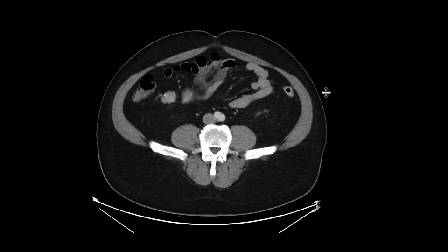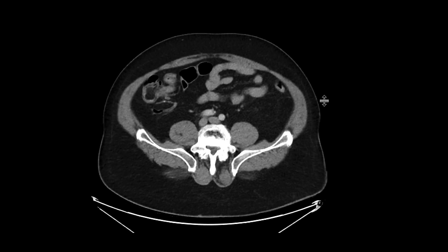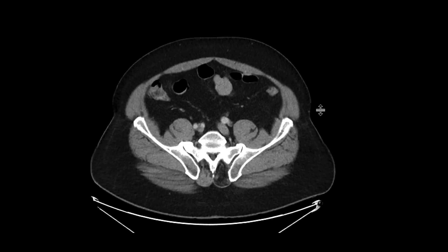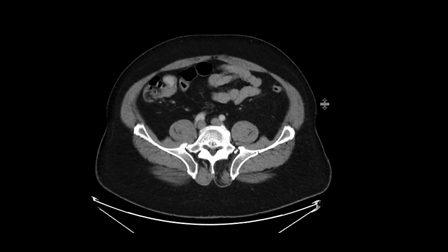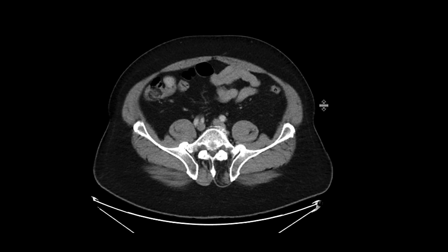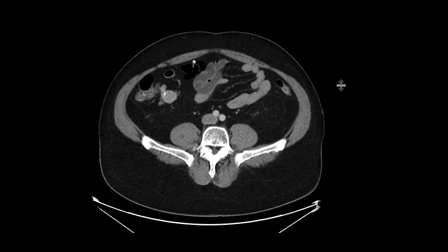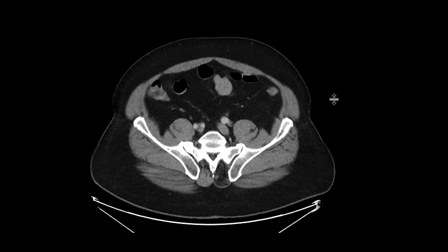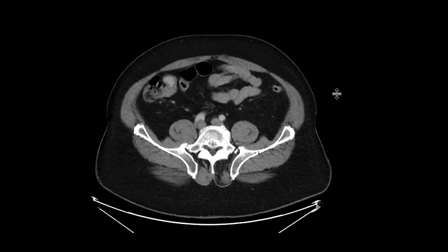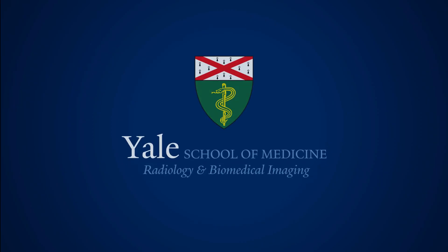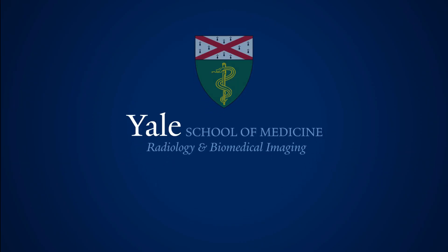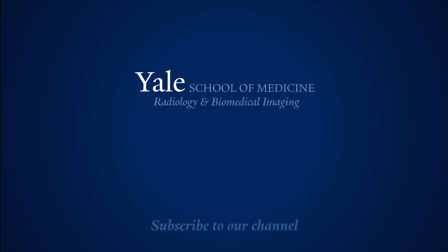Now, a lot of these carcinoids in the small bowel are going to arise from the ileum, so it's important to look at the ileum to see if we can find the primary neoplasm. In this instance it's subtle, but it's right there — we can see that there's this nodular mass within the terminal ileum, and that's going to be the primary site of disease in this patient who had path-proven carcinoid tumor.